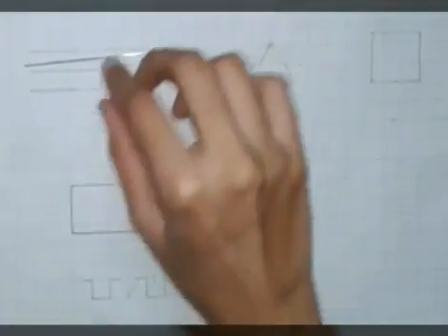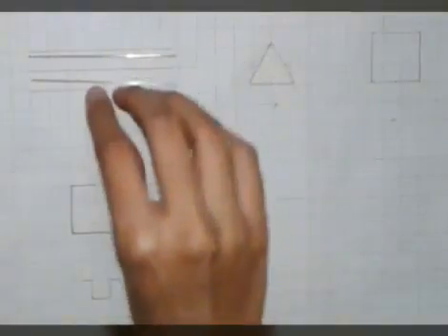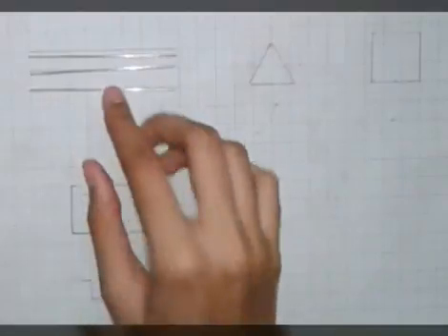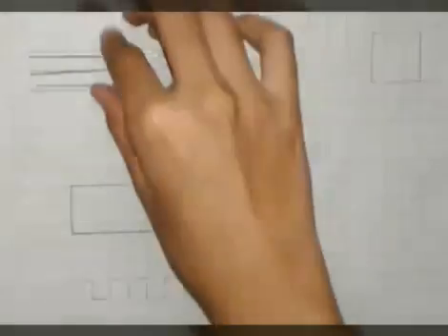This is the graph sheet, which is used to learn wire bending. According to this graph sheet, we want to bend the wire as a triangle, square and rectangle. Now I am arranging the straight wires. We want to do three straight wires for learning purpose for beginners. After that, we want to do the triangle.